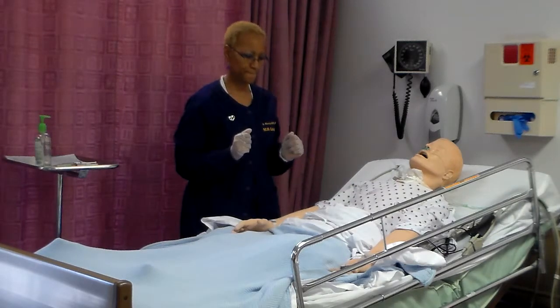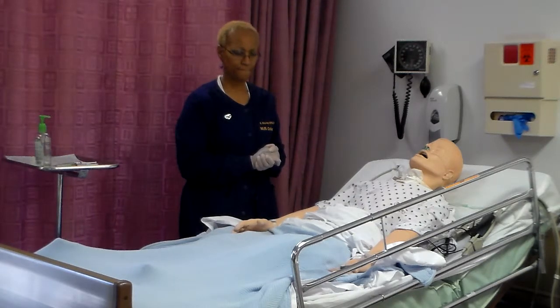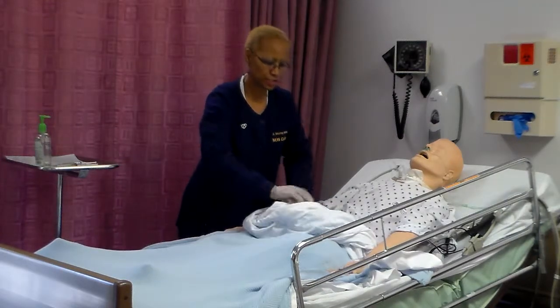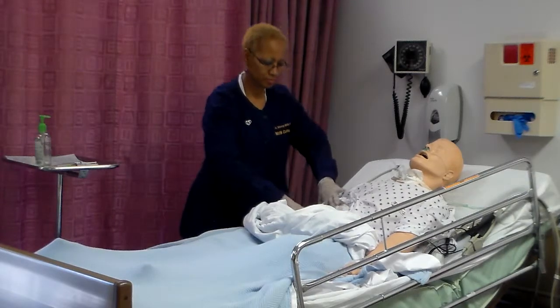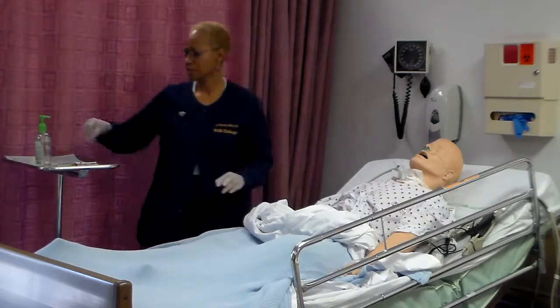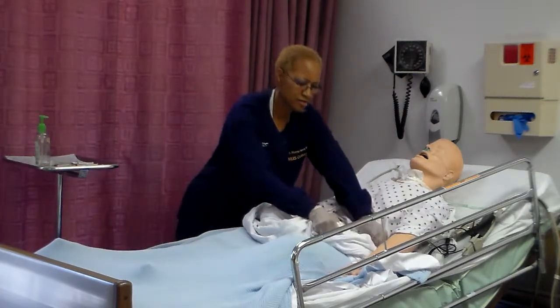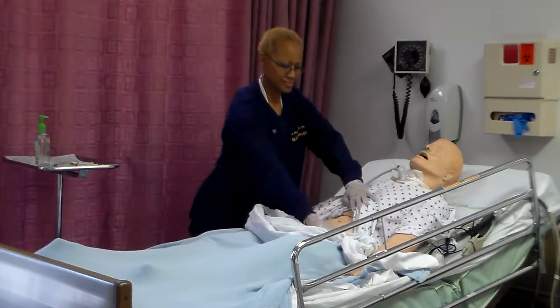Select appropriate injection site. Inspect skin surface over sites for bruises, inflammation, or edema. Okay, so Mr. Johnson is going to get 3 injections. He's going to get a sub-Q injection into his abdomen. Subcutaneous. Palpate sites for masses or tenderness. Avoid these areas. For daily insulin, rotate site daily.